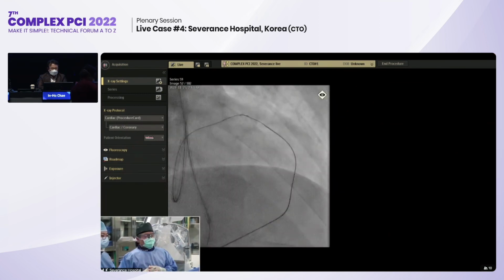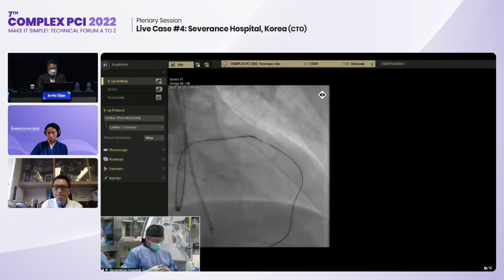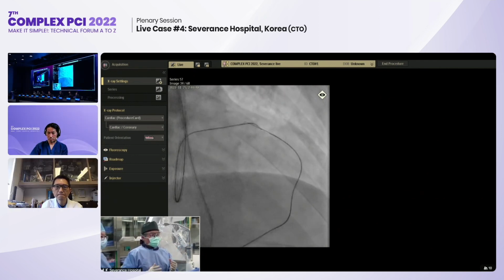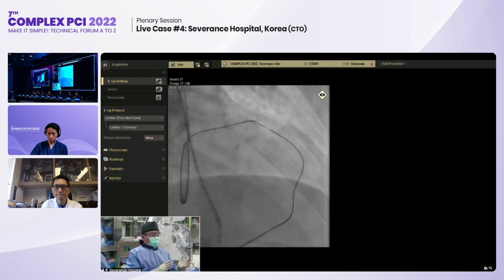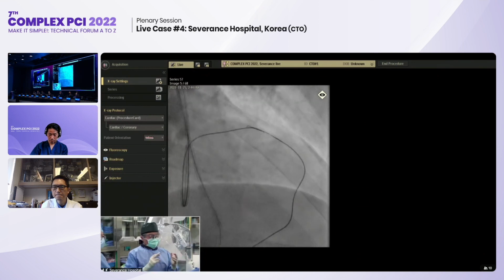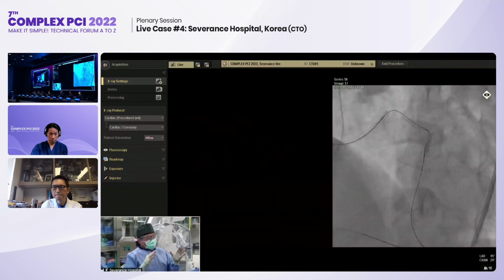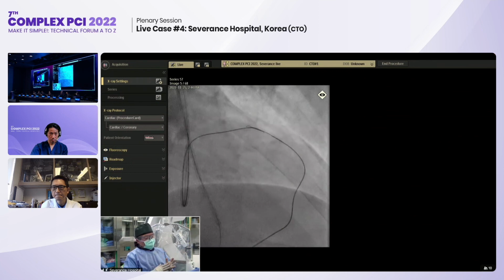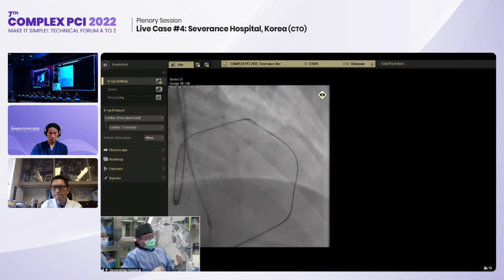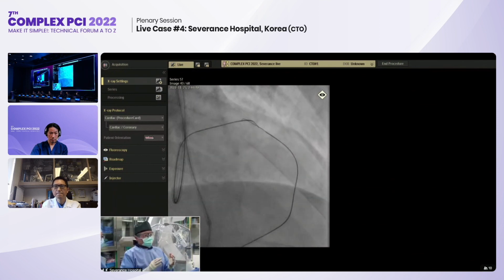So Professor Che mentioned redirection of some antegrade guidewire, not just the proximal cap but the middle portion, previously subintimal, like this. And next one. In this step, the antegrade Corsair Pro X moved very smoothly, and I think the wire gap is a little bit reduced.